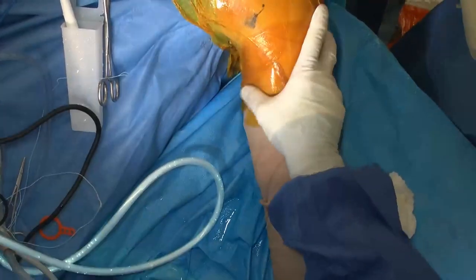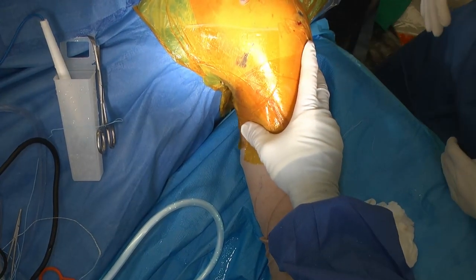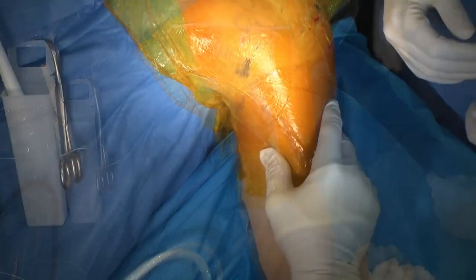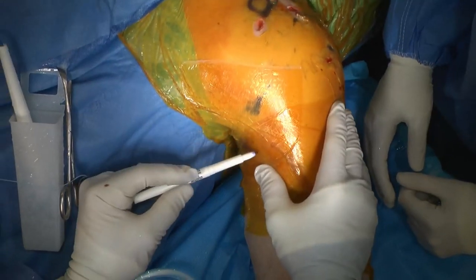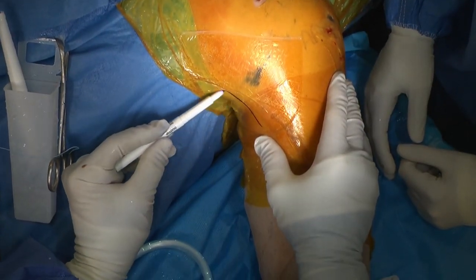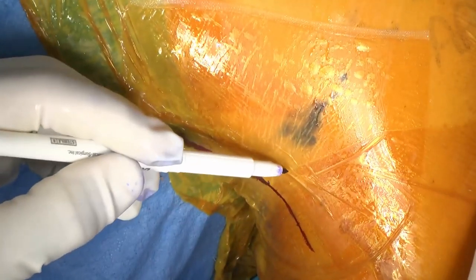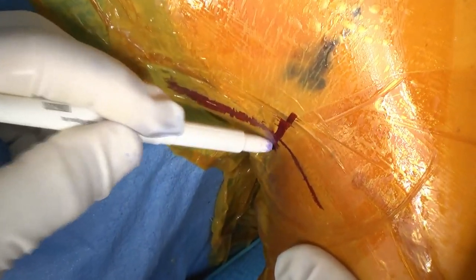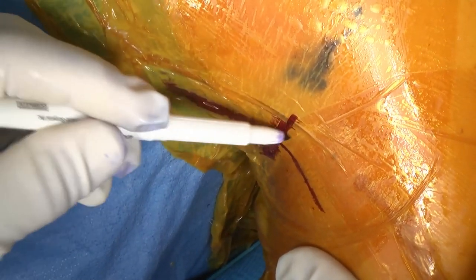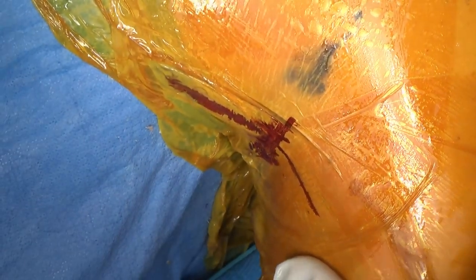Okay, marking pen. Do you have some local anesthetic? Okay. So our pec muscle comes here. And so our line is this, and we can feel our bicipital groove. What we'd like to do is go in line with one of the skin lines, or Langer's lines, right here at the lateral aspect of the axilla. And that'll bring us right down to the biceps in the subpectoral region.